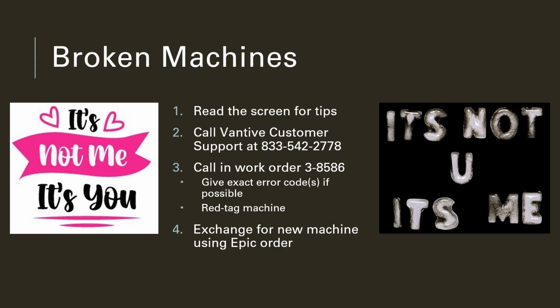One thing you can do is call in a work order for the nurses, and this is really important. If a machine is broken, you can call the IT help desk at 38586, and if possible, give the exact error code. Somebody on the unit should then red tag the machine and have Agility exchange it. The nurses, like I said, this is something that you can offer to do because this is something that we're struggling with as an enterprise.